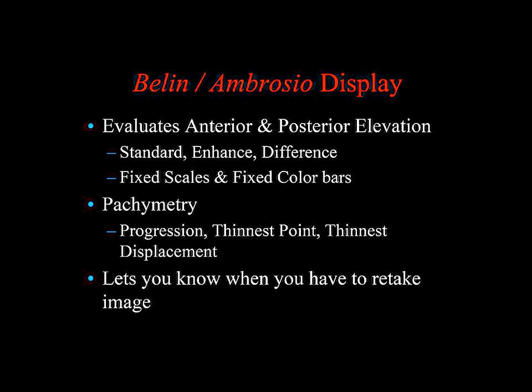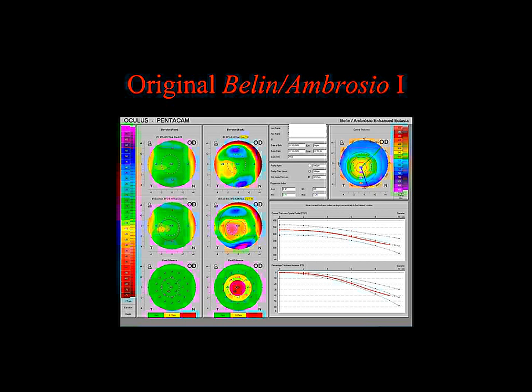And that led us to try to develop a map that combines that information with a lot of work done by Renato Ambrosio on pachymetry. And let's just go to the next picture. So this was the first, quote, Belin-Ambrosio display.